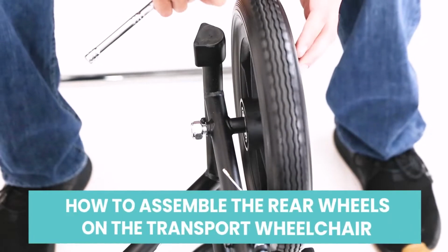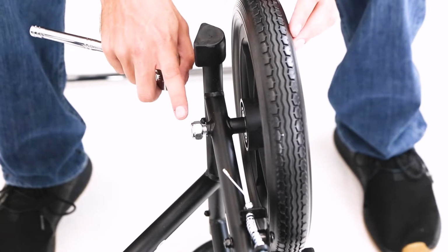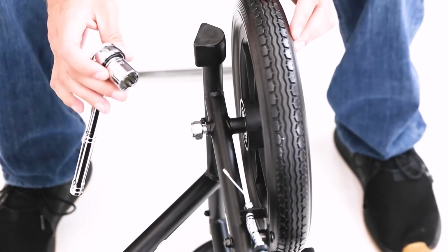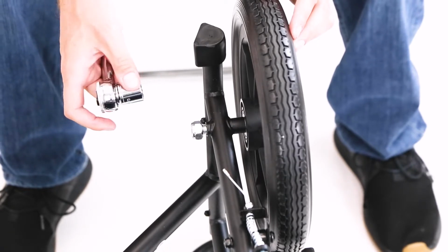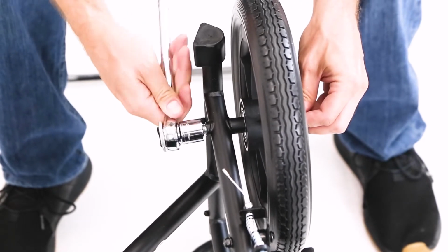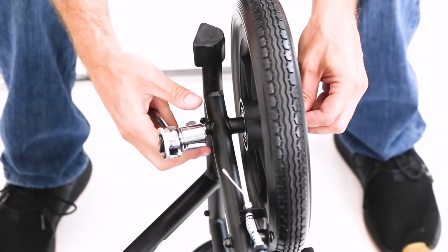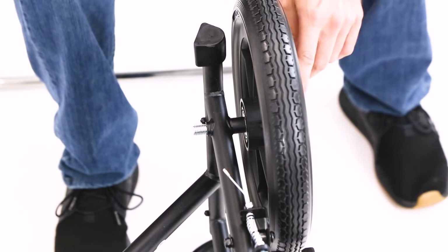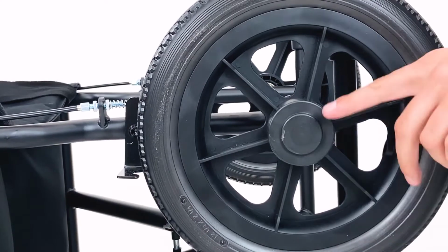So to replace the wheel on your transport chair, the first step will be to remove this back bolt. You can use a wrench or a socket wrench, and this is a 3/4 of an inch fitting. And we'll just turn it. I already had it kind of loosened up there for us. And remove this here.